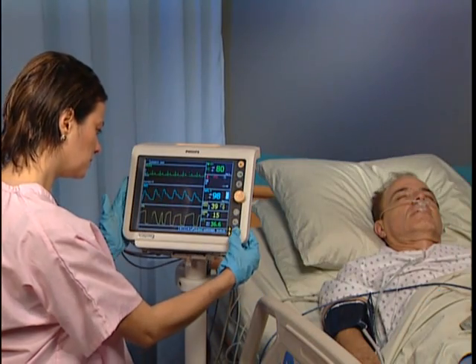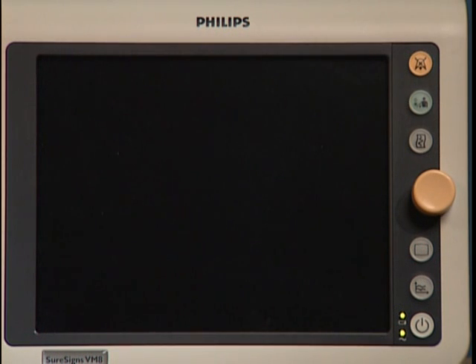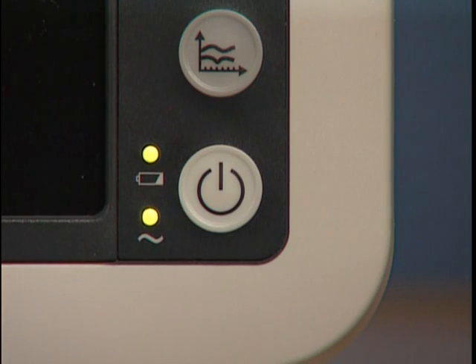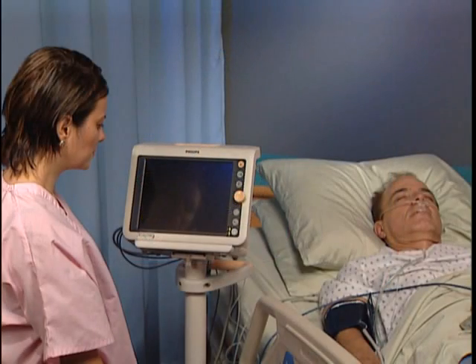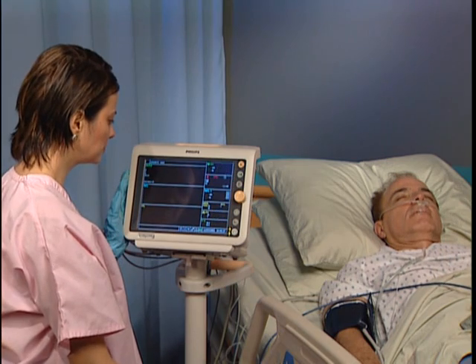If you press the ON standby button while the monitor is on, the monitor goes into standby mode. The display goes blank. Battery charging continues as long as the monitor is connected to an AC power source. Trend data remains in memory, but monitoring stops. To resume normal monitoring, press the ON standby button again.